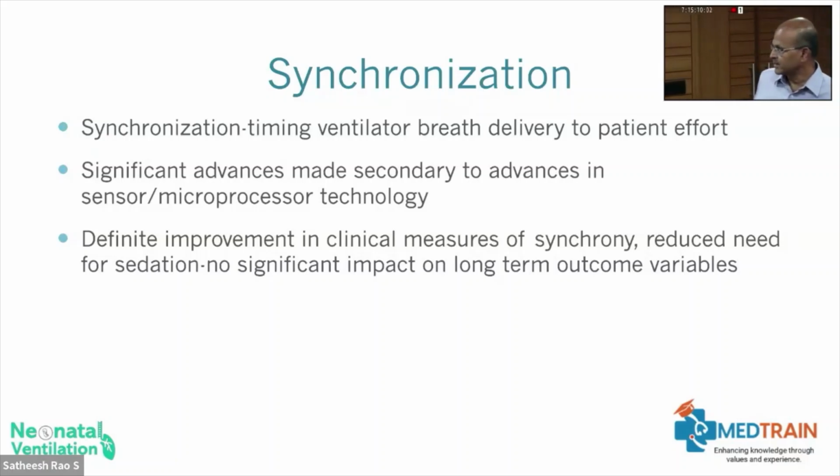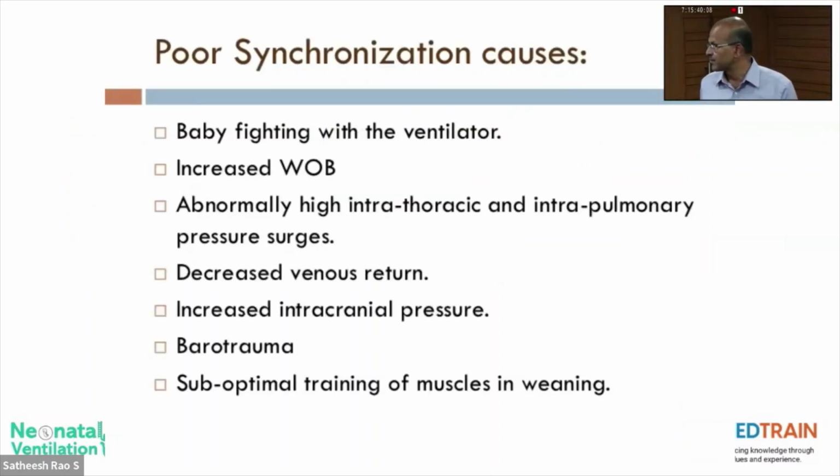And lots of changes: it's much quicker microprocessor technology, the speed at which the flow sensor is picking up, and the sensitivity is very good. Of course, the modern modes like volume guarantee depend on picking up information as well. So synchronization needs the flow sensor and these measurements, and the modes also come through that. As I mentioned, there is definite improvement in clinical measures of synchrony and reduced need for sedation, but no significant impact demonstrated on the long-term outcomes.